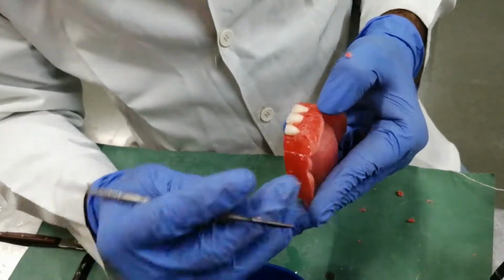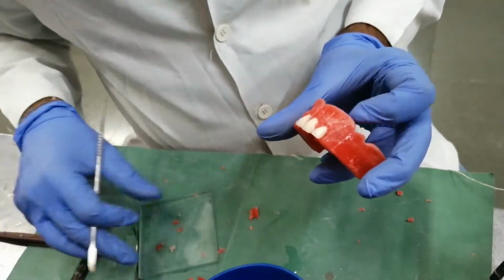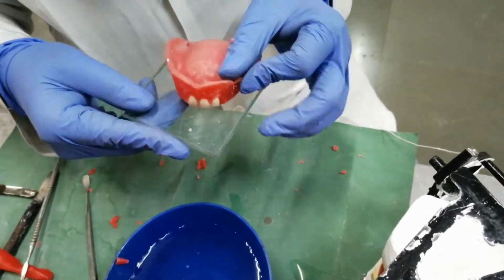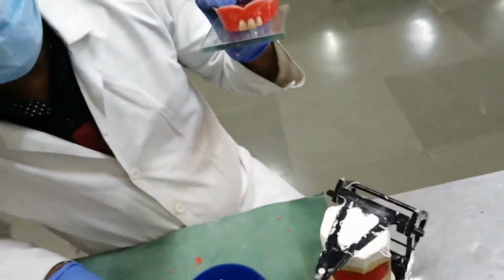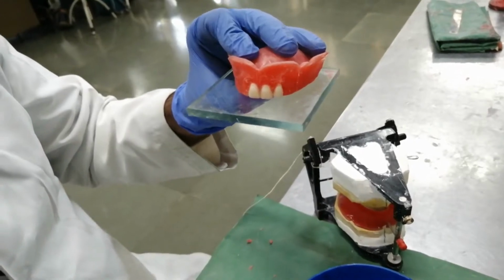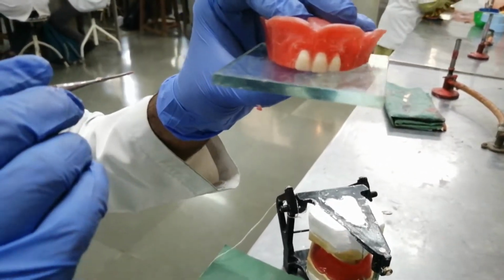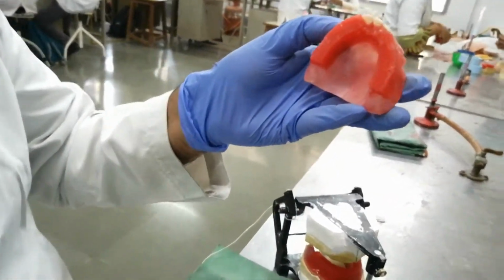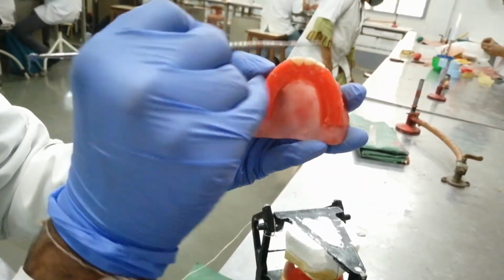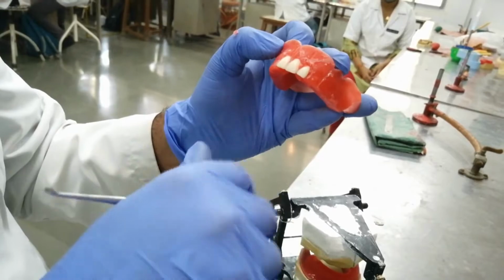You can see the neck of the lateral incisor. It is slightly depressed as compared to the central incisors. You can see onto the glass plate, the lateral incisor's incisal edge is 0.5 mm above the glass plate. You can see from this view, the incisal edges are following the arch form, and the alignment of the incisal edges is along the outer edge of the rim.